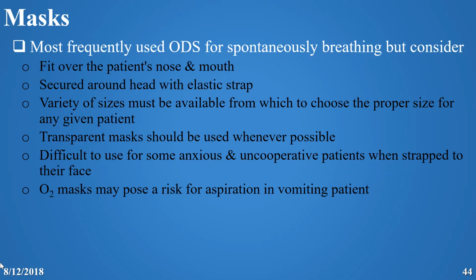Mask is a very good option to deliver oxygen. So it's a very good oxygen delivery system, but the patient has to breathe on his or her own. The mask can fit the patient's nose and mouth, and it can be secured around the head by an elastic strap.